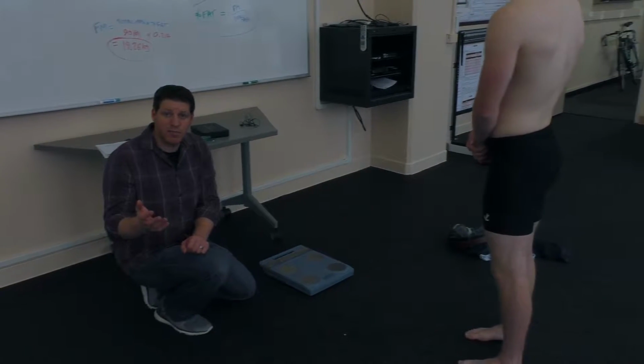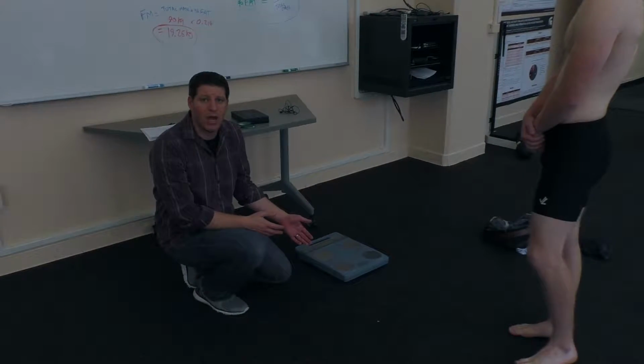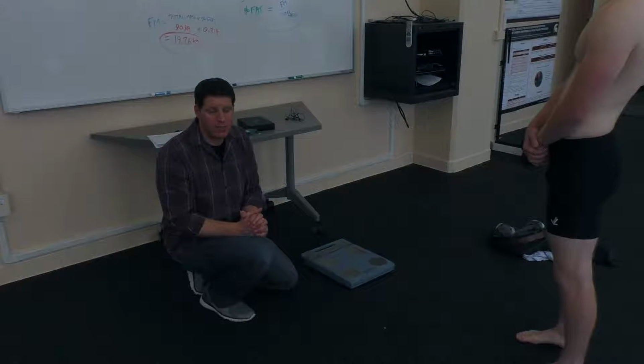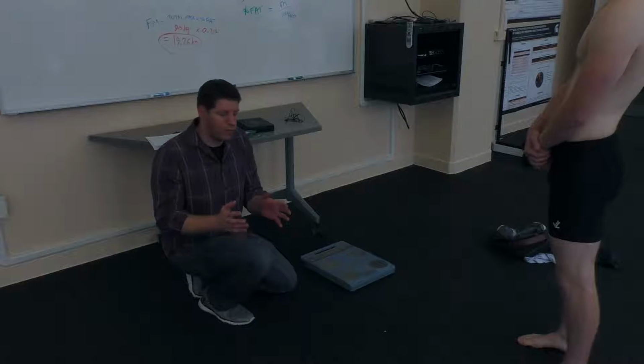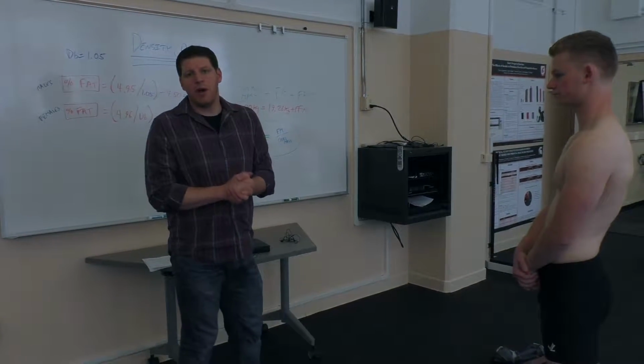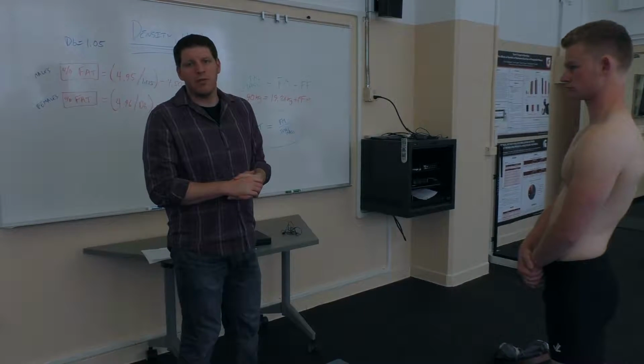Even the most expensive BIA devices, such as this here, which is over $1,000, believe it or not, have some severe limitations with hydration status. So again, I'd be very careful. The nice thing about BIA is there's no easier method of body composition assessment. Literally within seconds, you can have a percent fat value.